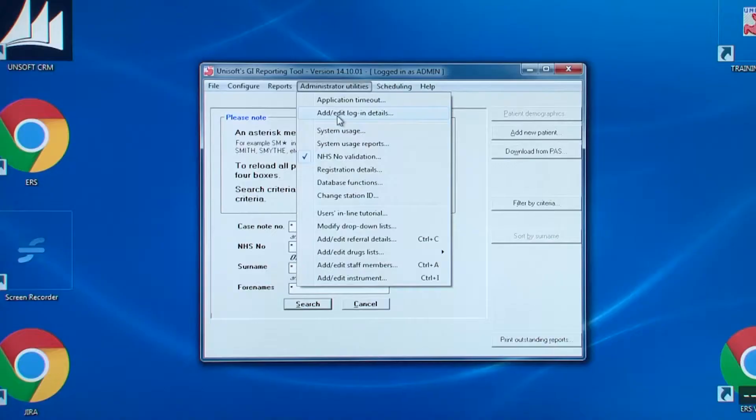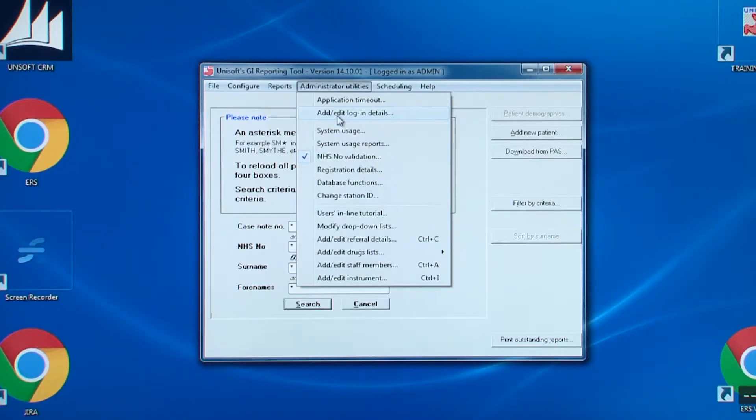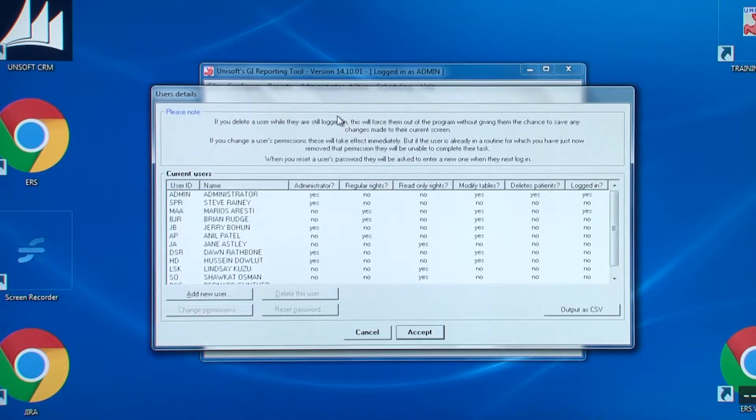So there is an entry in the administrator utilities menu for adding staff members. There is also one final entry. This is for adding and editing the referring consultants, many of whom may not require logins. So back to the screen, this is the entry for adding logins.